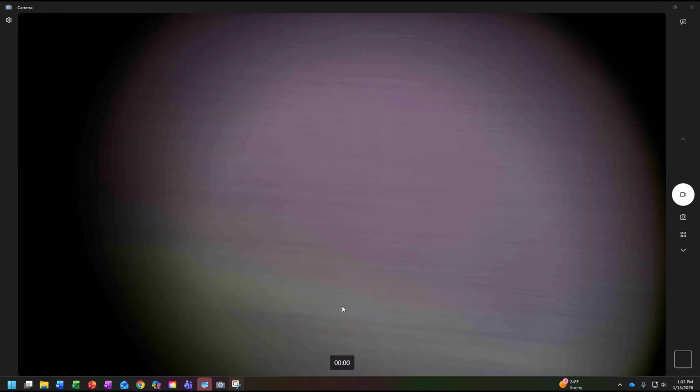So let's go ahead and look at the 400x view. Again, this is not anything I would test you over in my class, but I just want to look at stuff because, I don't know, microscopy is fun. I like this stuff. I like looking at things. It's like looking at artwork.